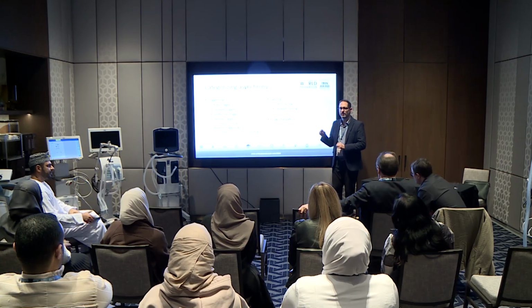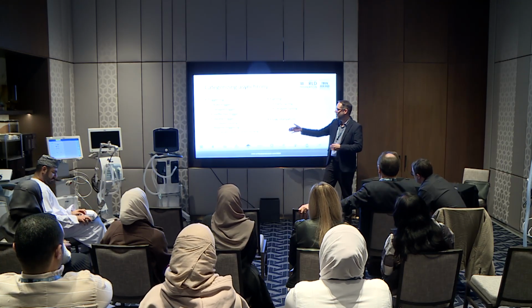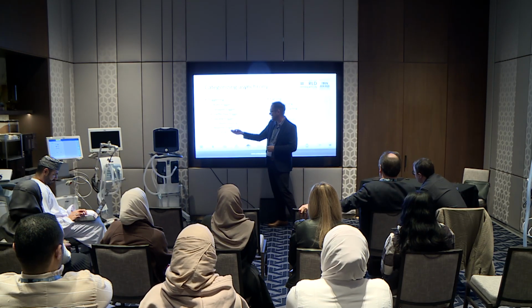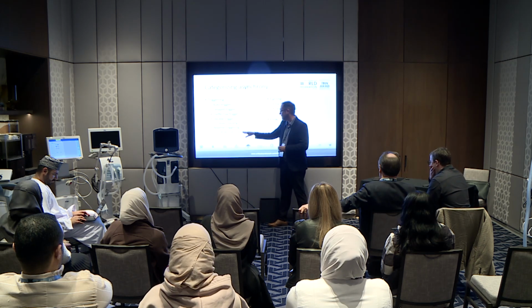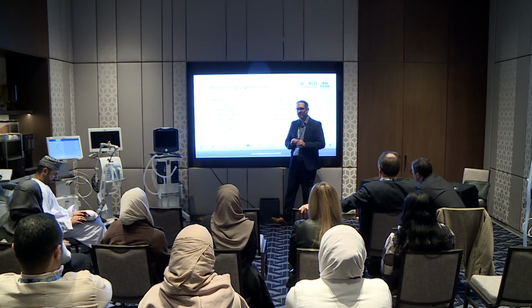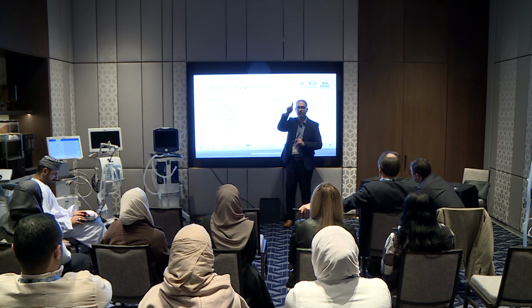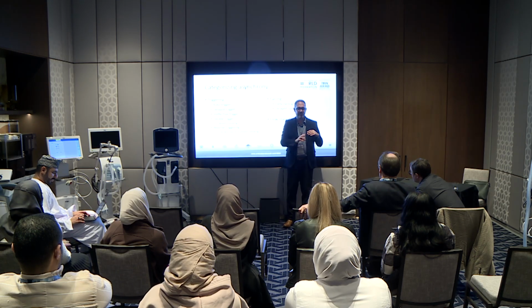Now I'm going to show you my preferred method of classifying, which is not this, but just so you know, we have triggering: auto trigger, delayed trigger, ineffective trigger, double triggering, which leads to breath stacking. Reverse triggering can also result in breath stacking. But when I talk about reverse triggering, I want you to understand, because some people misinterpret this. They think that for reverse triggering you have to have 2 breaths. Breath stacking is a consequence of reverse triggering, but it's not required.